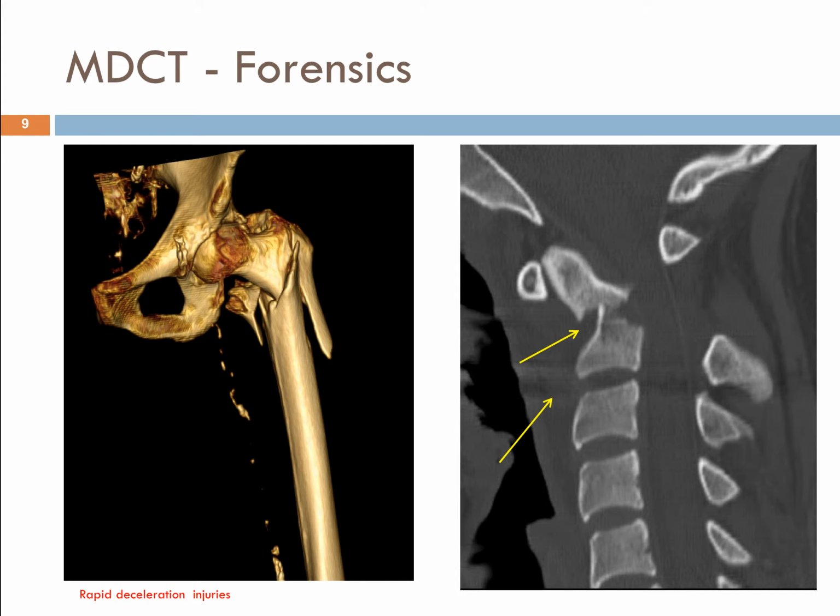These are some images from forensics. A lot of the forensic institutions around, especially Australia and Europe, are currently using CT. A little bit of MR, but mostly CT. They'll image all of their decedents that come through.